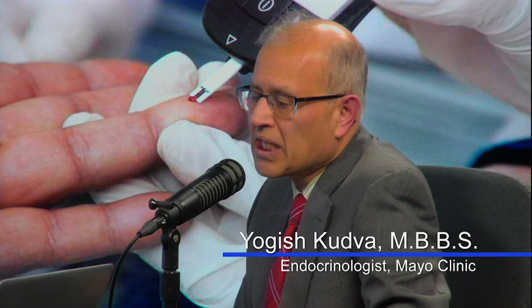If you read the popular press, they will also use another terminology for it, and it's called hybrid closed loop. Closed loop is just a terminology indicating that the components of the system are interacting with each other. So the loop is closed, as opposed to an open loop where the information is given back to the patient to take a decision. The term hybrid is used because the insulin being delivered all the time is modulated with this control algorithm, but at mealtime, the patient needs to get involved and put certain information into the insulin pump in order to help control.